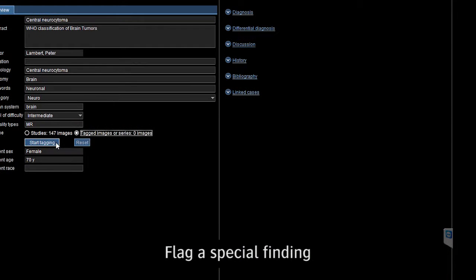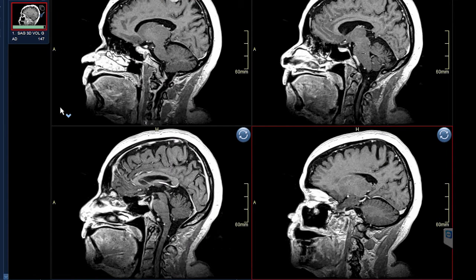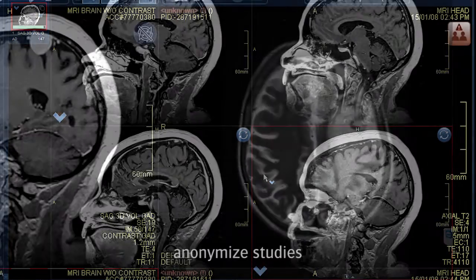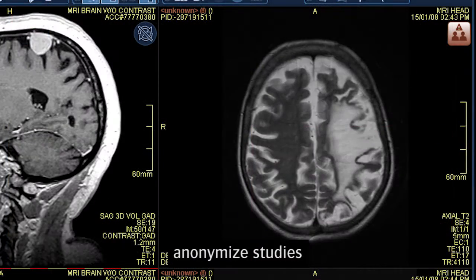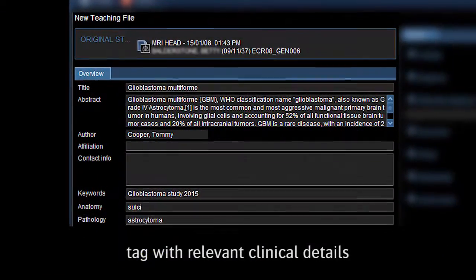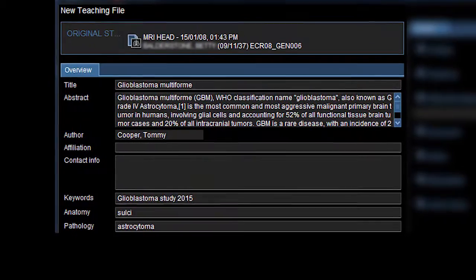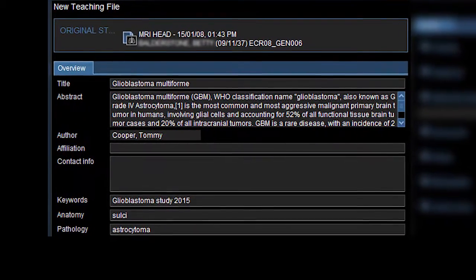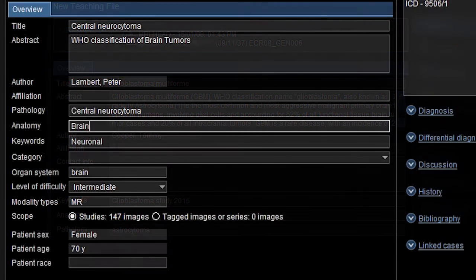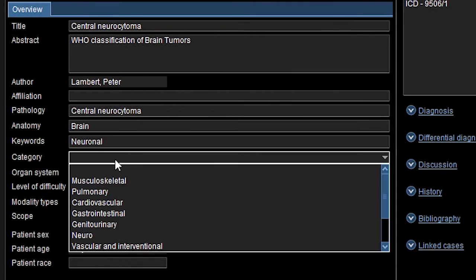But what if you could flag a special finding or interesting case easily in seconds? If you could anonymize images and studies and tag them with relevant clinical details with just one click. If you could include pathology, anatomy, and keywords — you can.